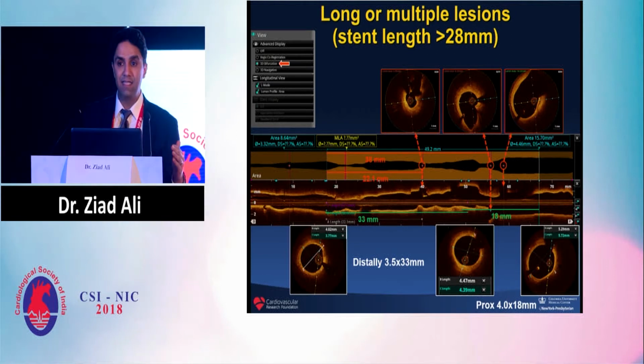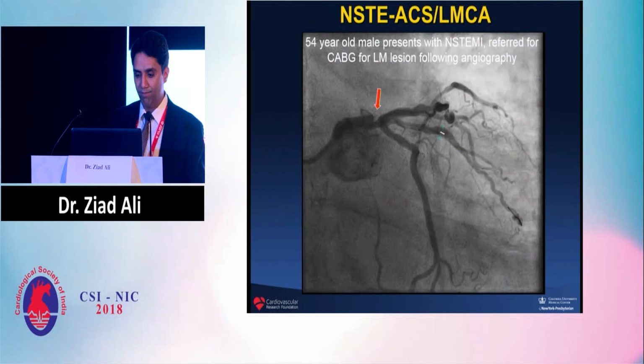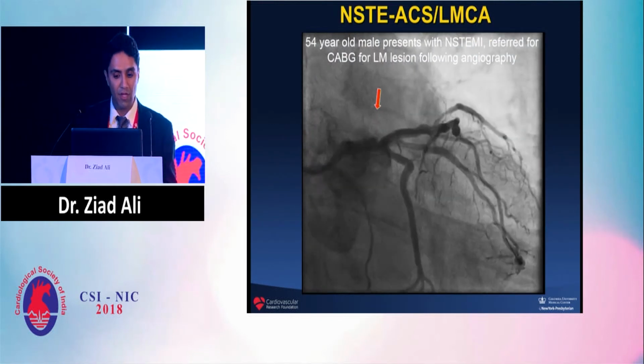And actually, these stents have dynamic ranges which should not be overcome, after which the polymer and drug become unreliable. What about non-ST elevation ACS?